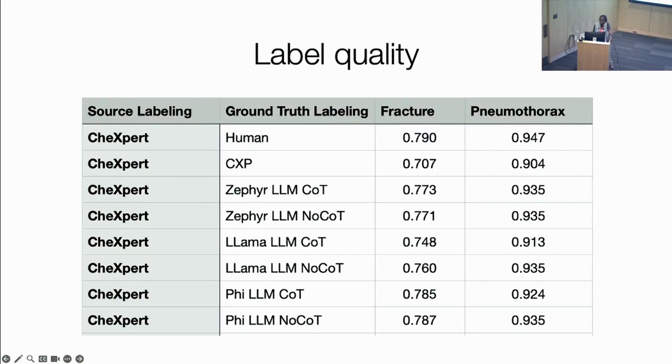And in fact, based on our work, I suggest that you just figure out how to use LLMs for your own QC of the labeling for the training data set. And then for the test data set, you invest in the human annotators, because they're expensive. And so the models seem to be very forgiving. And for the radiology report, because it's short, it turns out that the lighter models, those that can even run on your laptop, are okay for these predictions. And so I think that's been a good lesson for us as we move forward.